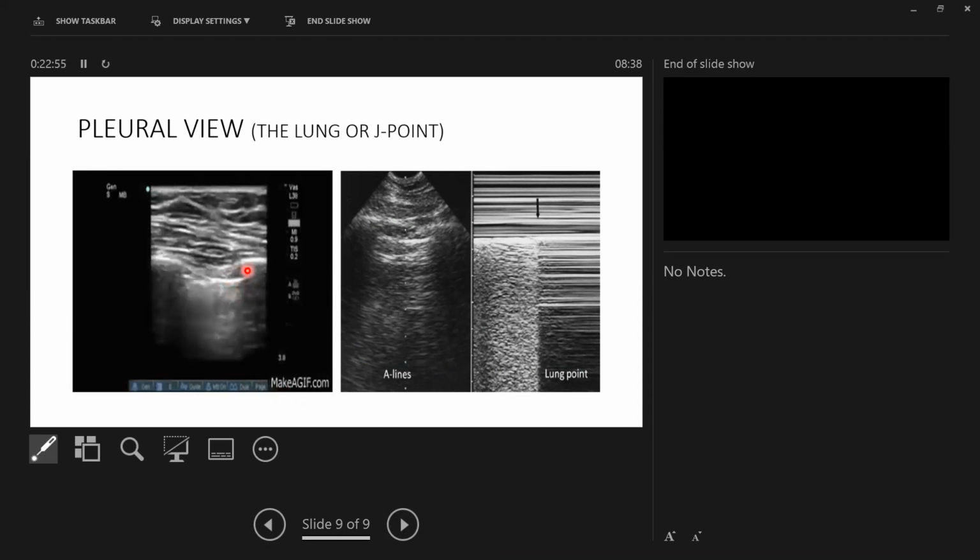Right? So what we see here, we see pleura that's not moving. Can you see that little section over there? Basically, there's no movement there. And then you compare it to this side, and you can see movement of that pleura over there. Right. So what it tells us is that up to that point, now this may be anywhere.